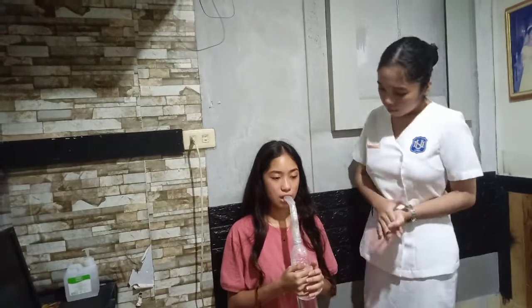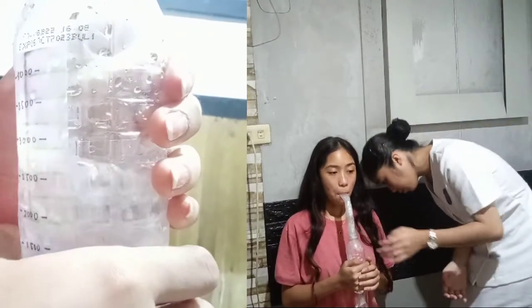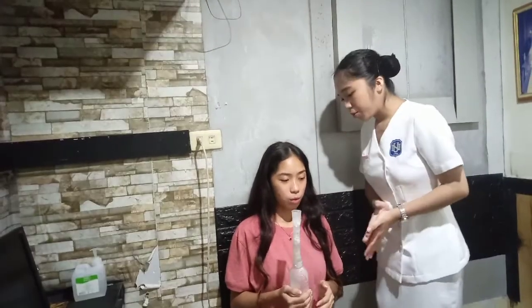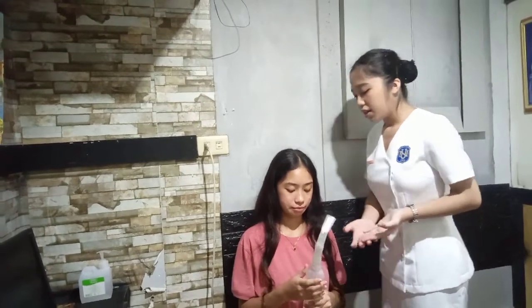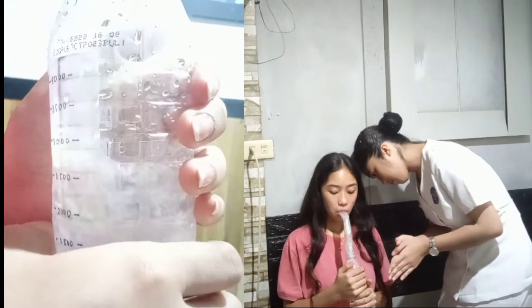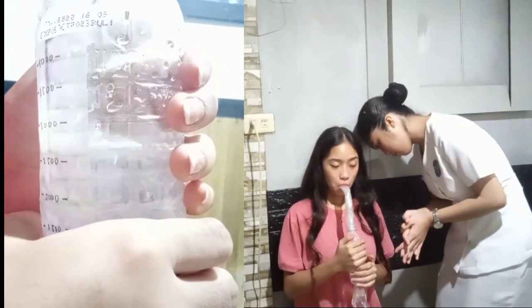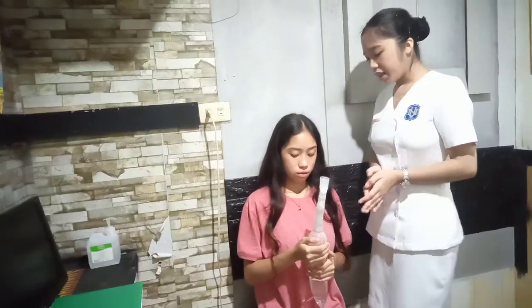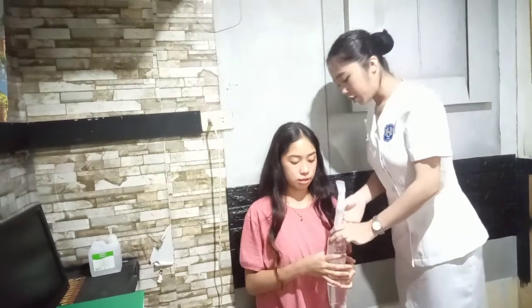Okay, thank you, Ms. Shensen. Now we have to hold for 3 seconds. Then we have to repeat the procedure. Okay, thank you, Ms. Shensen, for your participation. And now you have to cough 2 times. Okay, thank you, Ms. Shensen, for your participation.